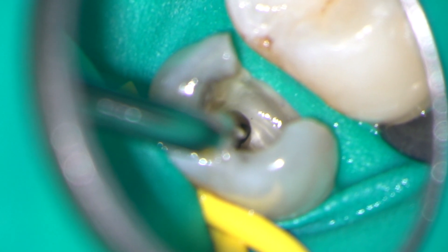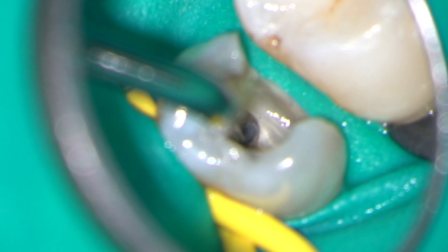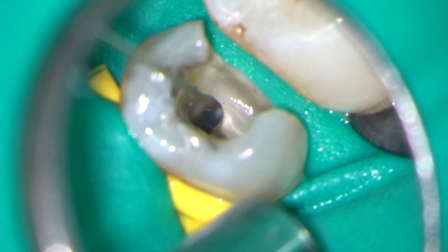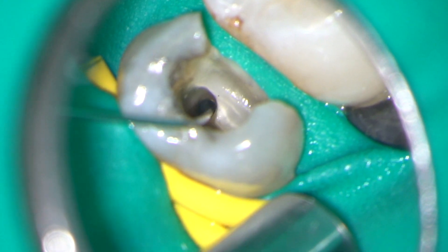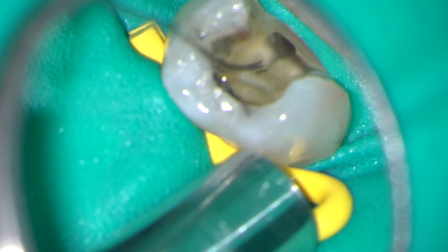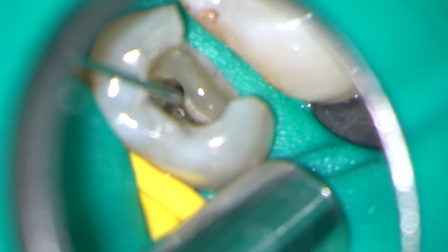Looking down the microscope at high magnification, I could see that the piece of fractured file had loosened nicely. I then used 3% sodium hypochlorite to irrigate the canal, and at this point the piece of fractured instrument was flushed out. I have used a freeze frame to highlight the moment at which it was retrieved. The fragment looked quite large on the radiograph but was actually rather small when it was removed, and this is often the case.